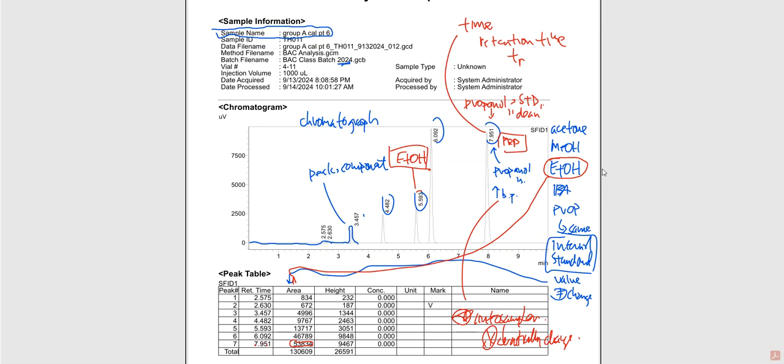That 53834 will fluctuate. The auto sampler is not perfect. Sample injection is not going to be the same from injection to injection. There are slight differences that begin to happen, and we can take care of those slight differences if we involve an internal standard, because it's checking my auto sampler to make sure it's performing the proper way.